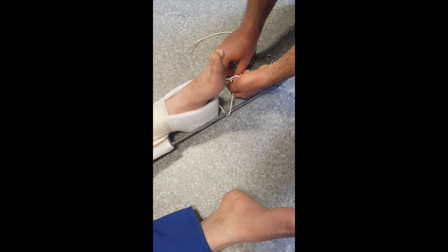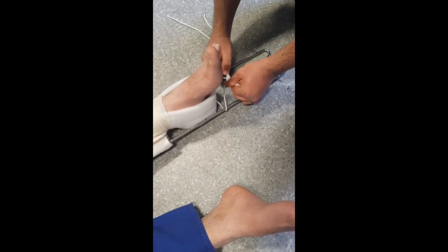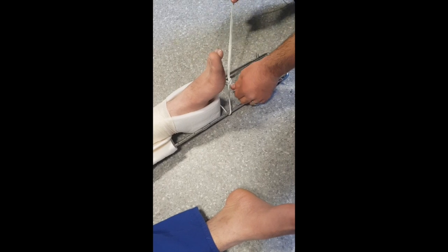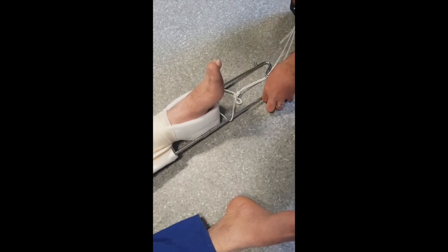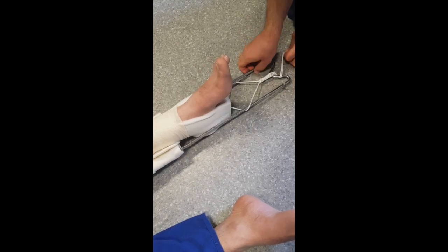We're now going to use the pulley method. Make a hoop and pass through the cord, making a little lasso. The ends are going to go over the end of the Thomas splint, and then pass through the eye of the little lasso. We can then pull on this and this is going to generate traction, and eventually you can finish this off with a clove hitch to secure your traction.